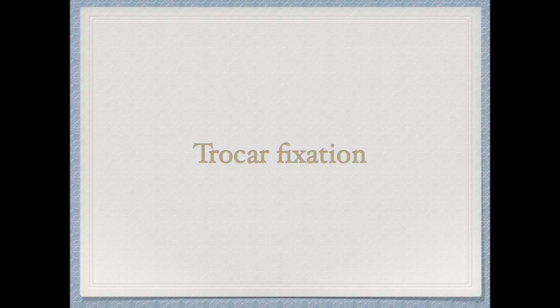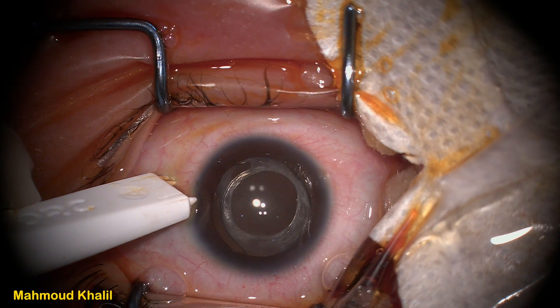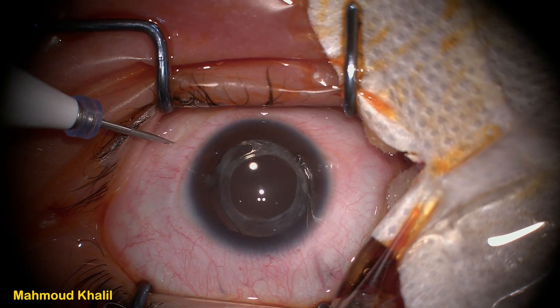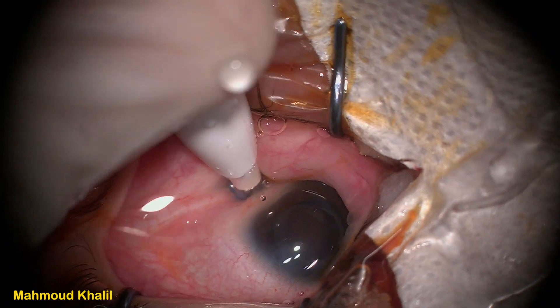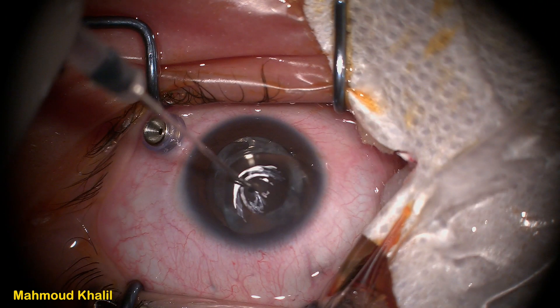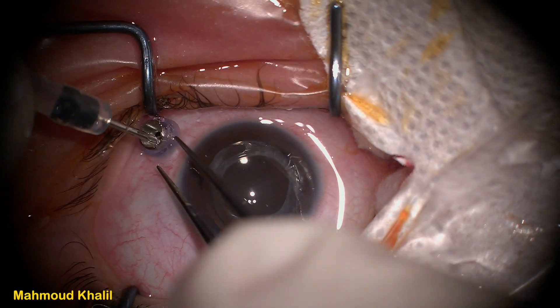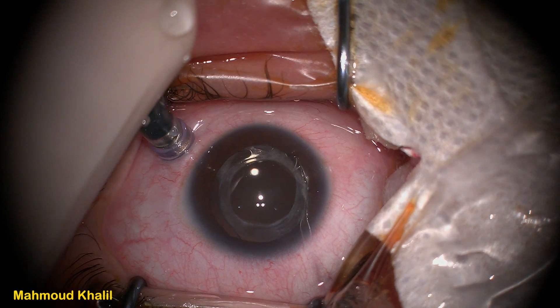Zoom in again with the microscope if needed, but always remember that higher magnification is accompanied by less resolution. After focusing, we begin trocar fixation. The trocar has three markers: the first is placed at the limbus, and the other two are at three and four millimeters from the limbus. In phakic eyes we place the trocar at four millimeters; in pseudophakic and aphakic eyes we place it at three-point-five and three millimeters. We start with the inferotemporal trocar, which is for the infusion cannula — the first one to be placed inside the eye.